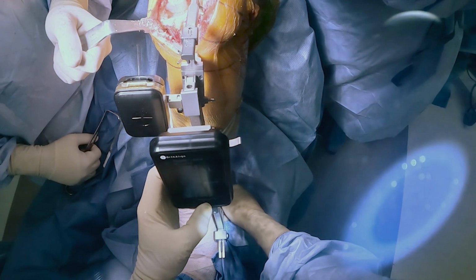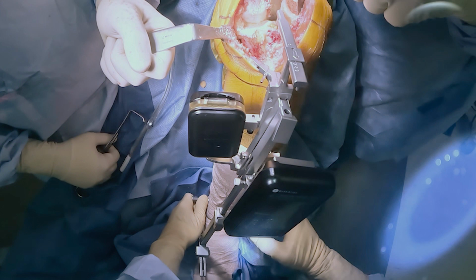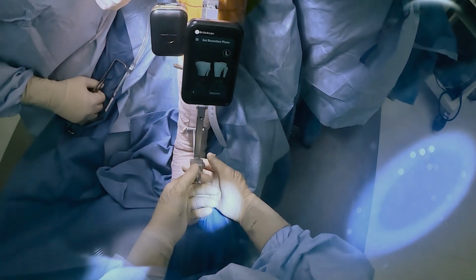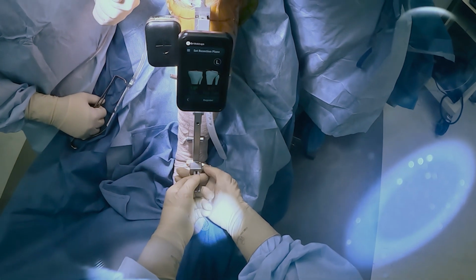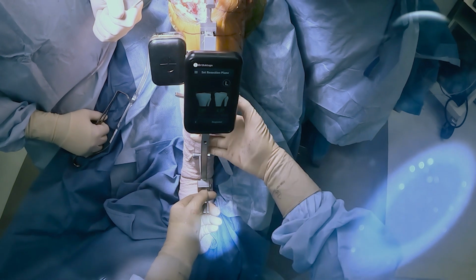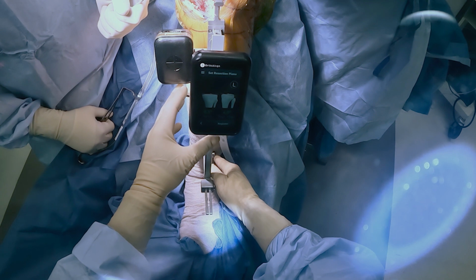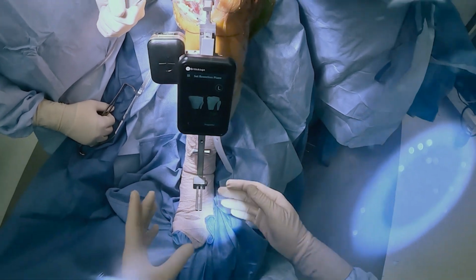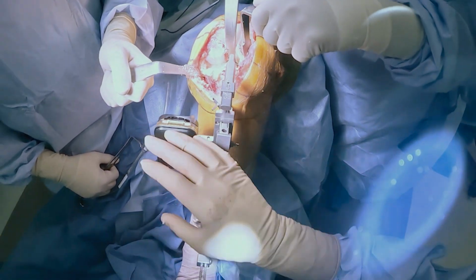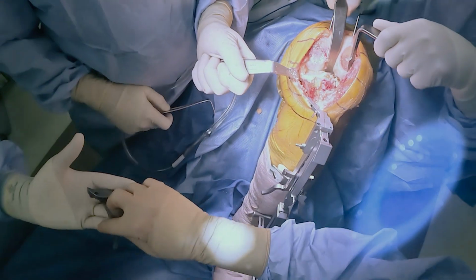I personally think that the tibial registration is the easiest part of the process. Here, the tibial jig is attached to the proximal tibia, and I'm registering the medial and lateral malleolus. We've already accounted for offset, which allows us to create a mechanical axis. This takes me approximately 2 to 3 seconds to do this whole process here. I personally will adjust the varus valgus slope according to the patient's knee as well as the deformities that I'm working with.